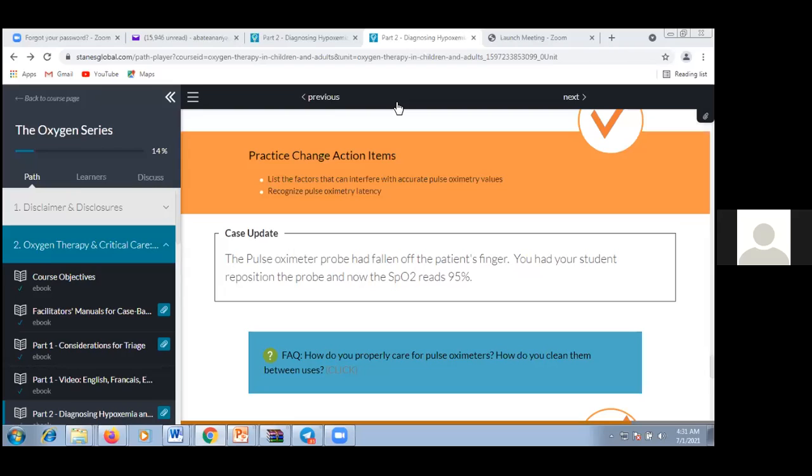So yeah, it's a very good question. Now, in case of shock or hypothermia or hemodynamic instability, it's very difficult to detect with pulse ox. But hypoxemia can be diagnosed either clinically or using more invasive methods like arterial blood gas analysis.